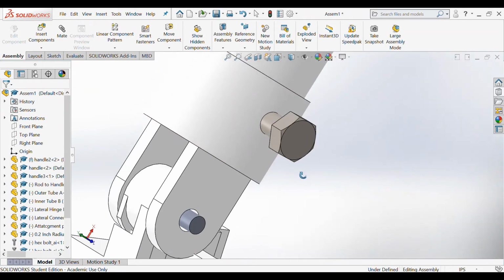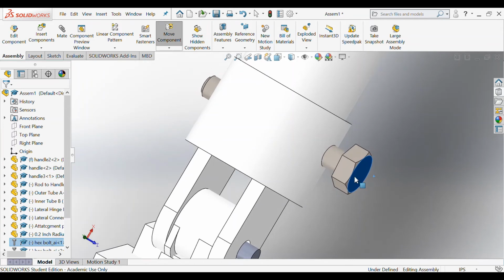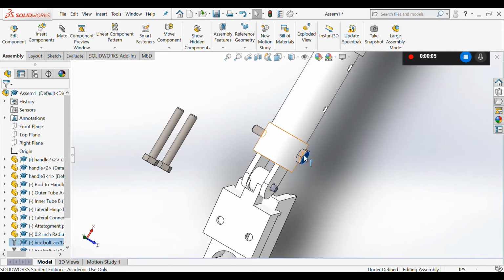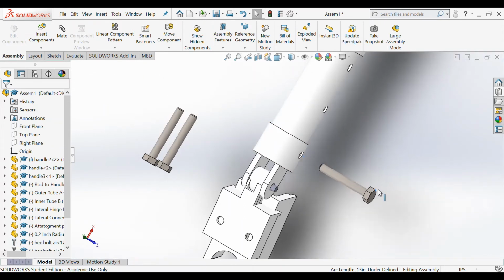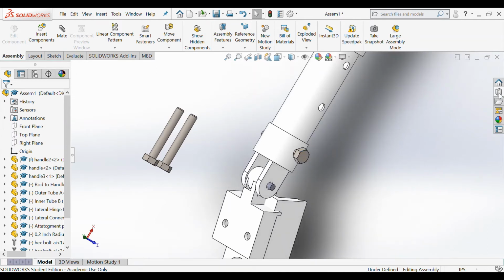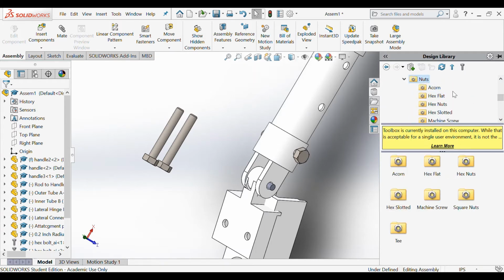So now we have this bolt concentric to the hole, but as you can see, it's not fixed in place. This piece right here is concentric, but it can still move in and out. So we need to fix it into place. So we're going to go to our Design Library toolbox and click on nuts. We're going to want hex nuts and then hex nut.